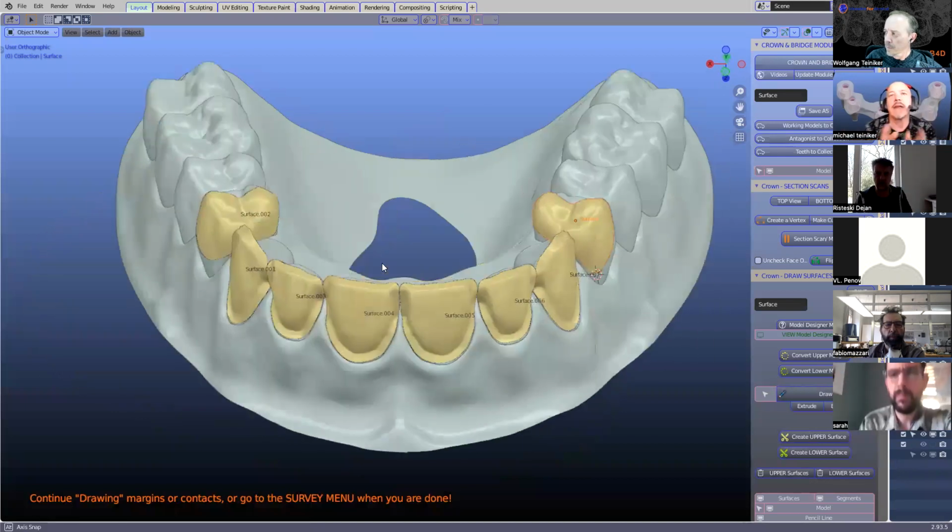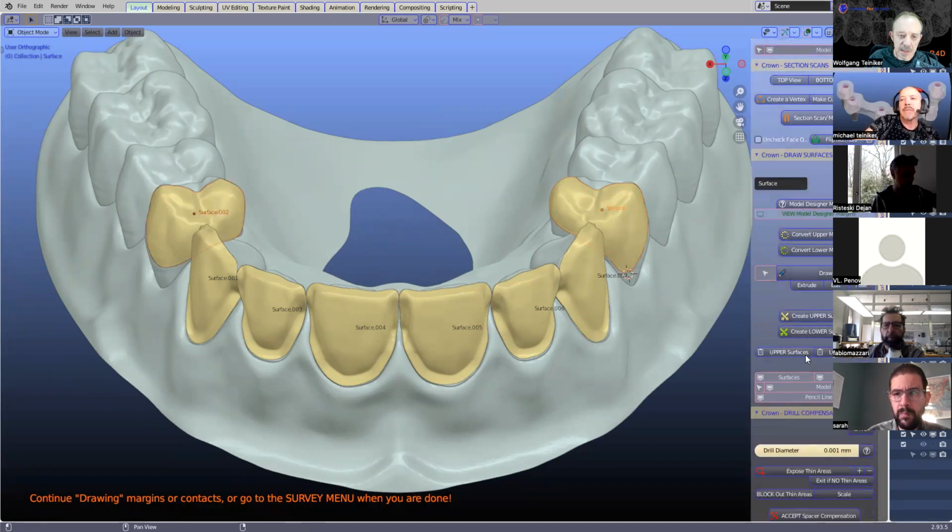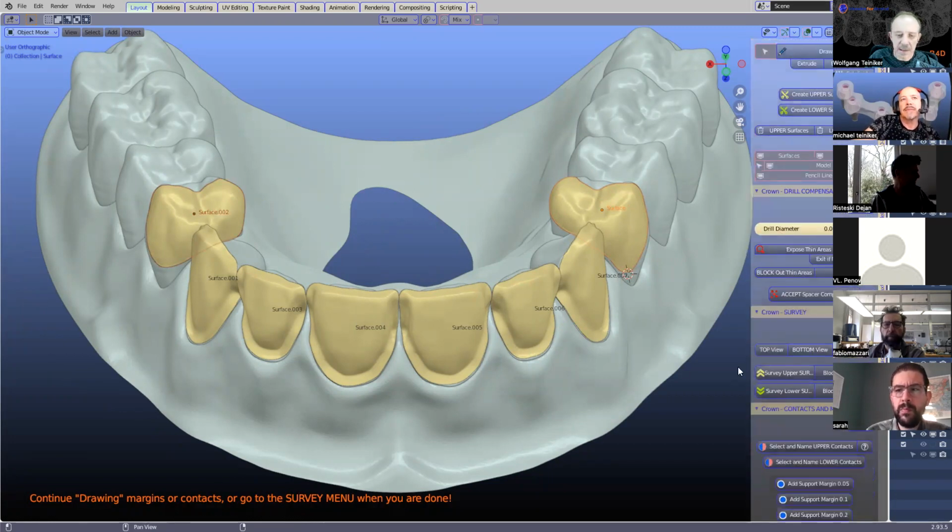Now we can't survey them all in one go because they are veneers. So Wolfgang, how would you survey the premolars? Well, how would you think? They're different from the veneers. Yeah, I'd probably take them together, maybe. Yes. And then the veneers, I probably split the veneer case up as well. So 2s and 2s and 2s, maybe.